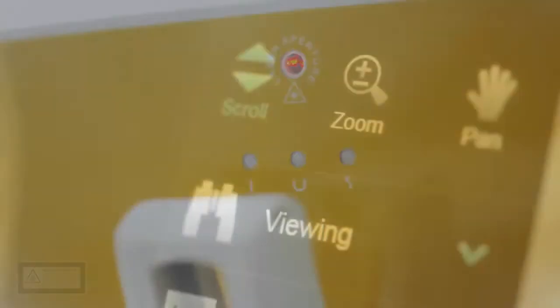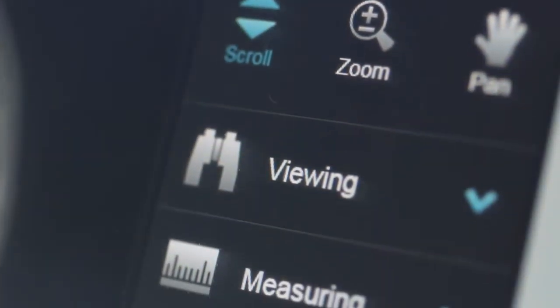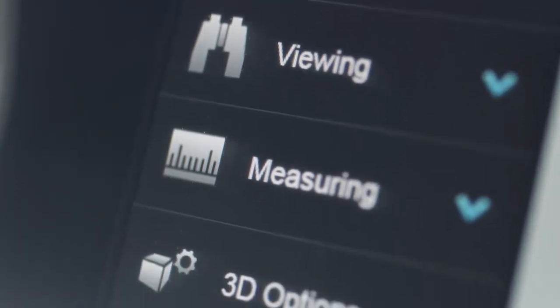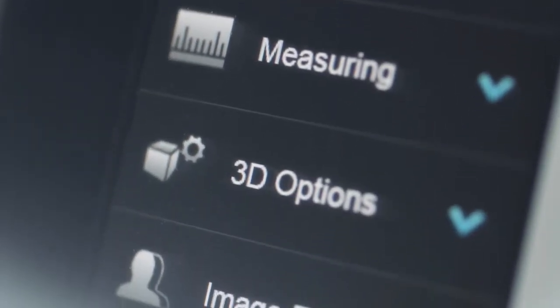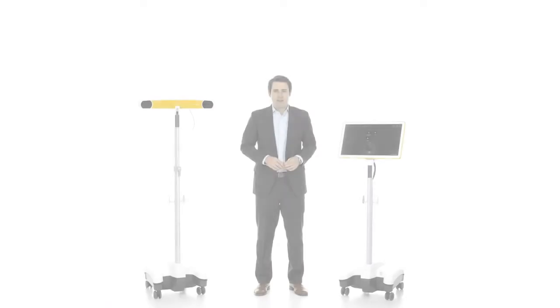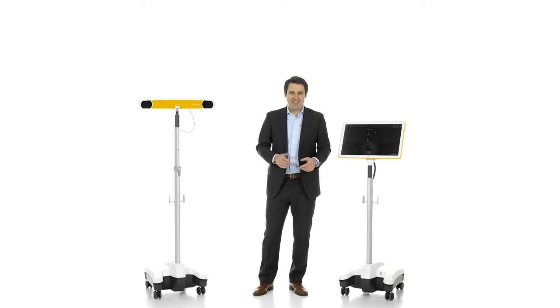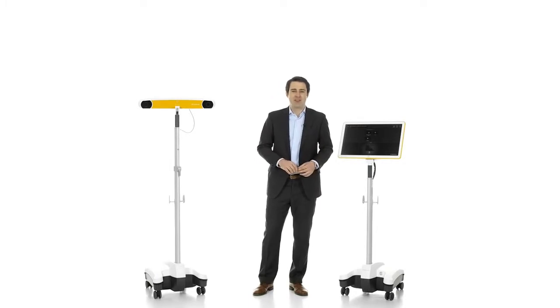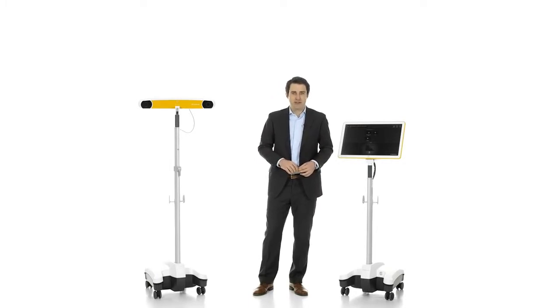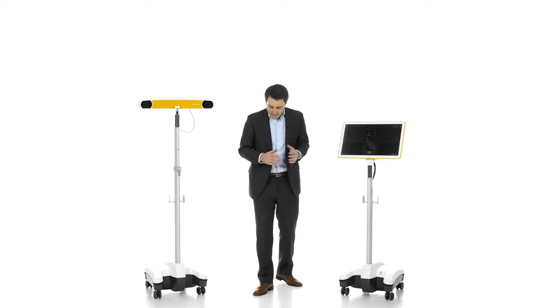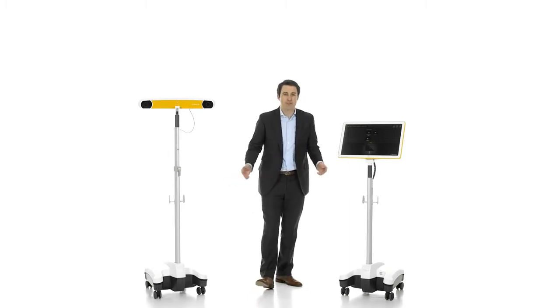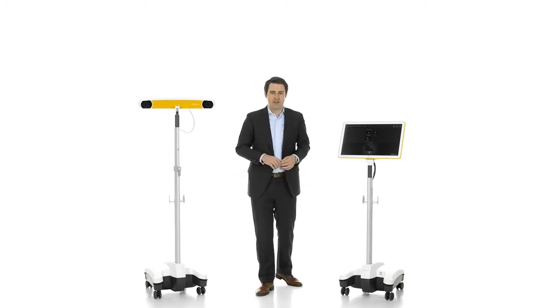Straightforward software control helps enable concentration on the patient. Powerful yet sleek, KIK is sculpted with an intentionally small footprint, allowing for agility in the OR and enabling maximum use of floor space during navigation.